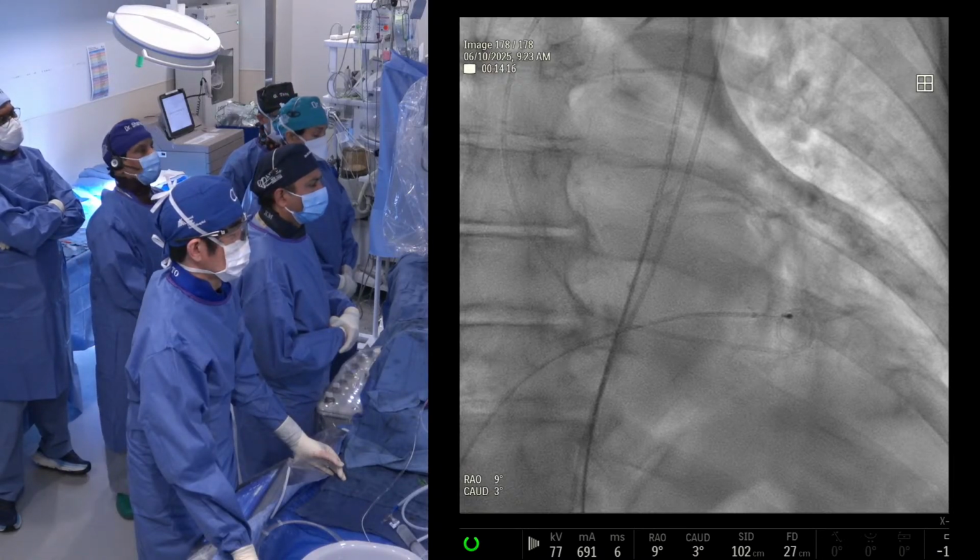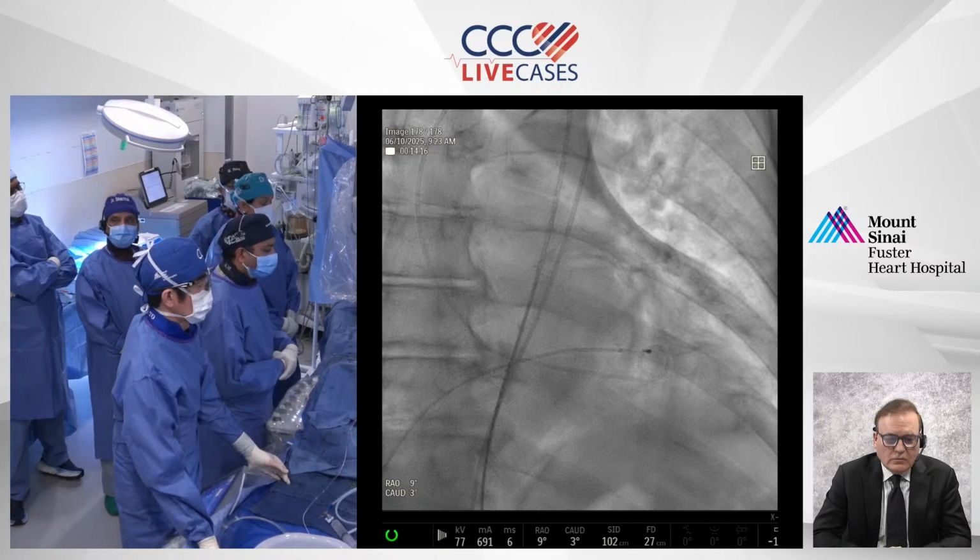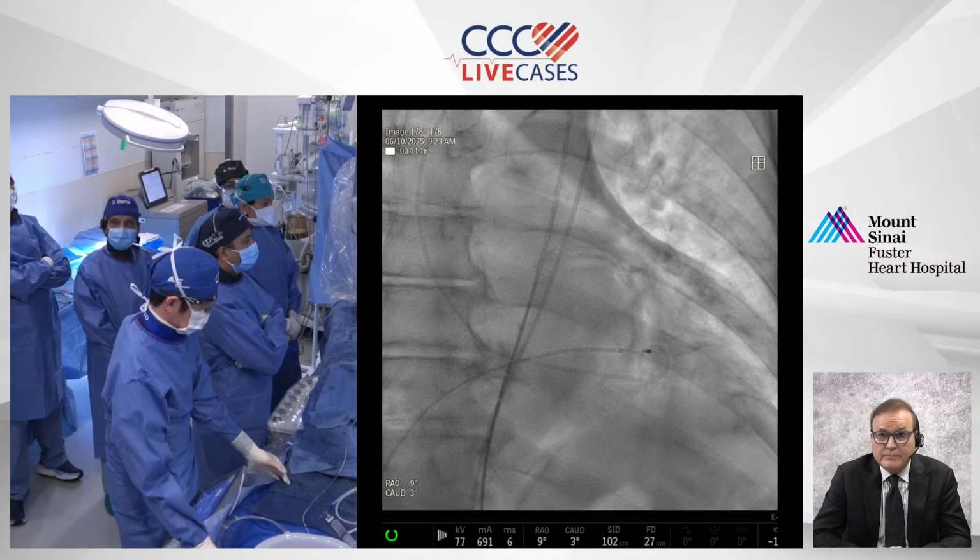Great. We have an activated audience today. So TAVR in the young, long-term durability, any data?